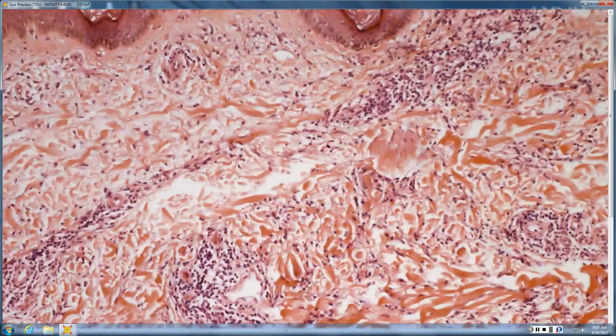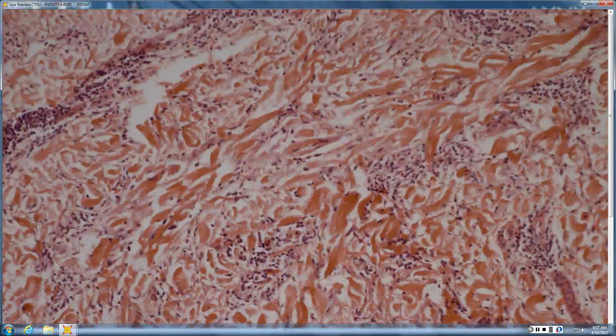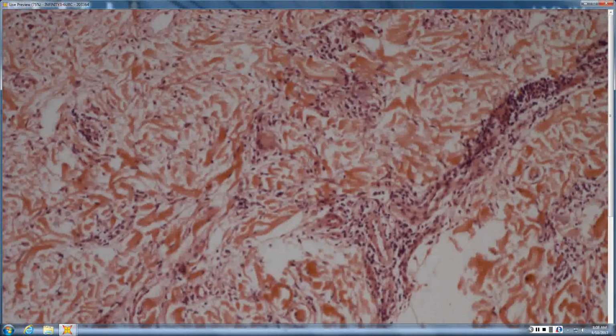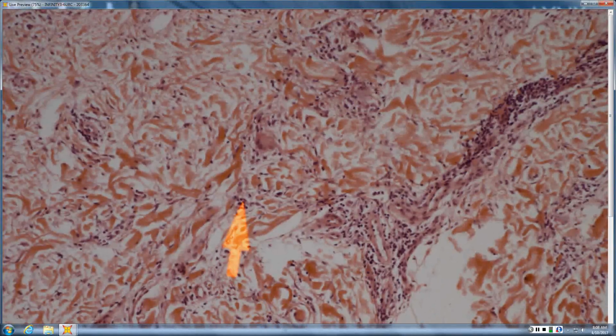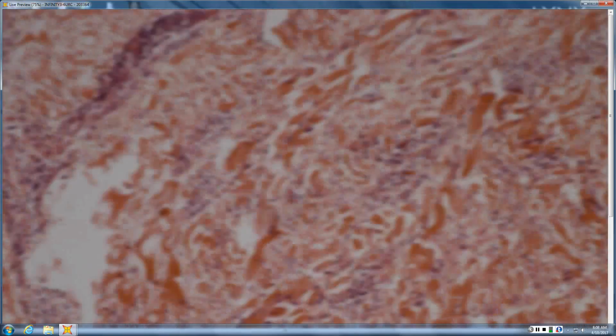We have an interstitial sort of lymphocytic infiltrate. Think about interstitial GA or GA. Yeah, I think that's a very good thought. Your question would be, there are some giant cells in there. The question would be how many other histiocytes are in here.